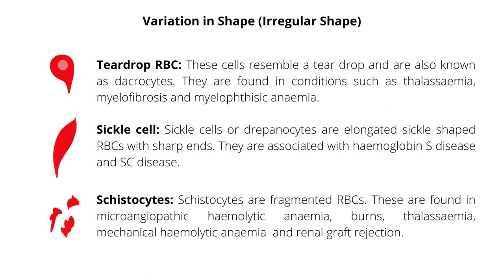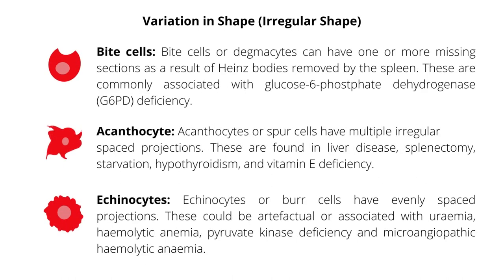Schistocytes are fragmented red blood cells. These are found in microangiopathic hemolytic anemia, burns, thalassemia, mechanical hemolytic anemia, and renal graft rejection. Bite cells or degmacytes can have one or more missing sections as a result of Heinz bodies removed by the spleen. These are commonly associated with glucose-6-phosphate dehydrogenase deficiency.